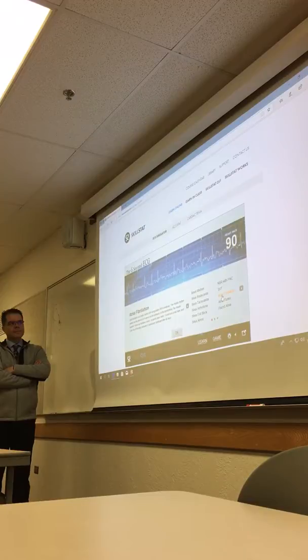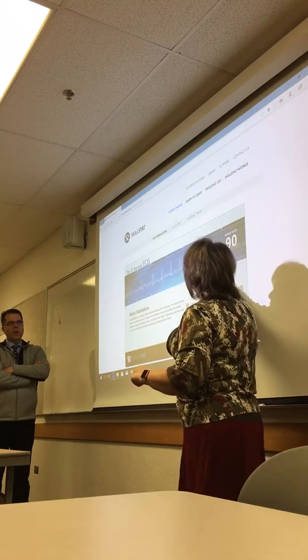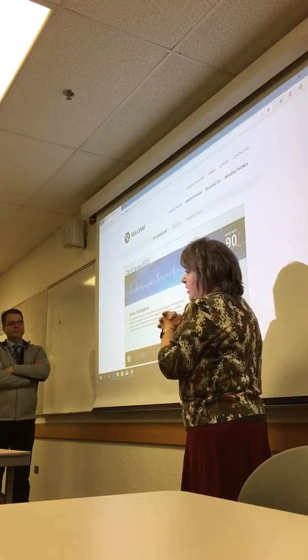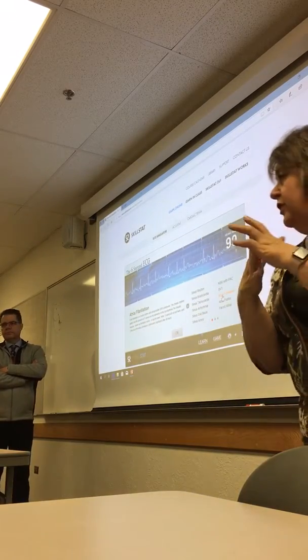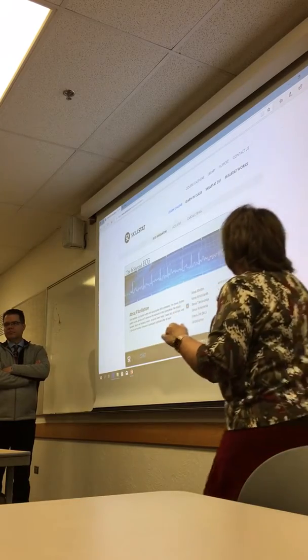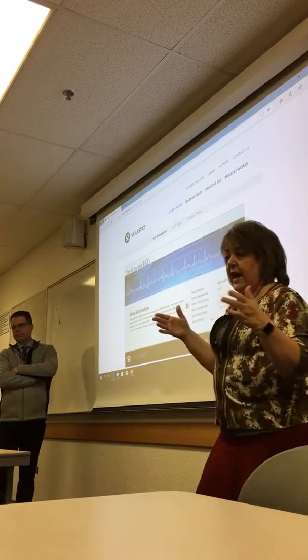Okay, we all know atrial fib, right? In your atrium, these are all impulses that are coming from various cells in the atrium. So this isn't all coming just from the SA node. And then some get through, and so then you get a QRS. Have you ever heard of atrial fibrillation with RVR? No. That is atrial fib with rapid ventricular response, which means a whole bunch of these impulses are going through. So now we're very tachycardic.